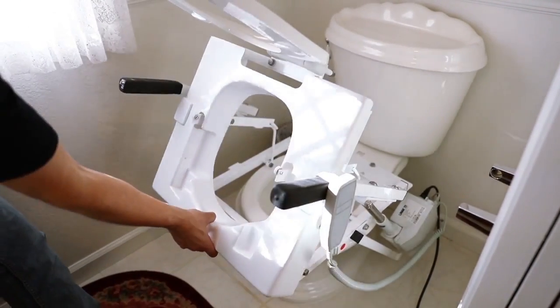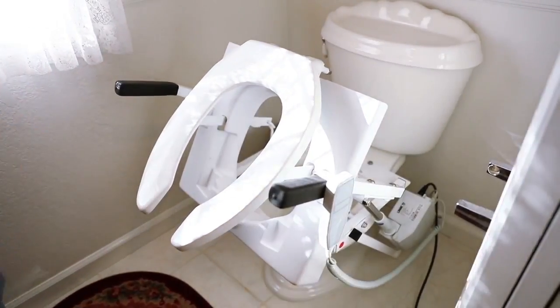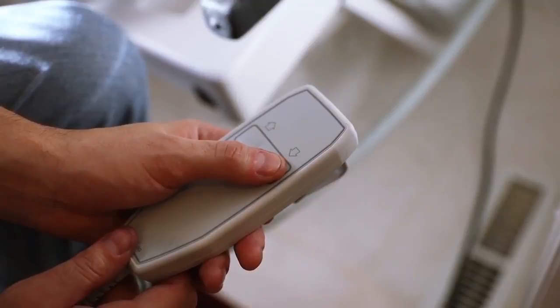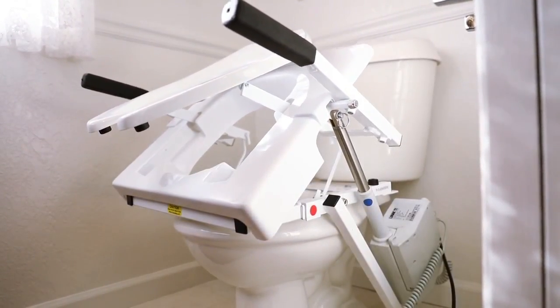Once the shield has been cleaned, you can reinstall it by placing it forward then downward in place on the frame. Using the push button control, lower the tilt into its down position and it's ready to be used.